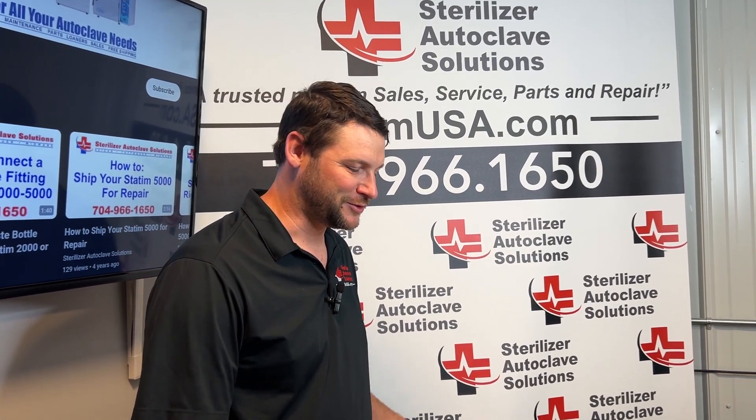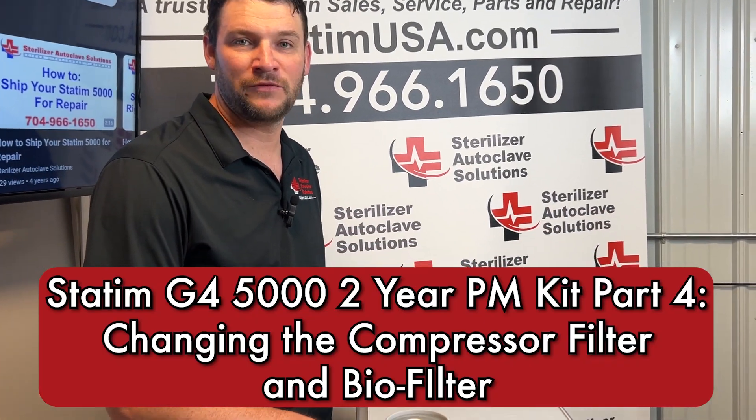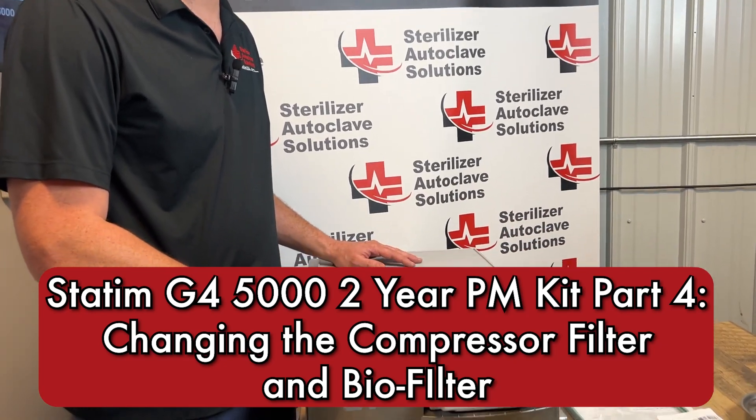Hi, this is Ian with Sterilizer Autoclave Solutions and today we are doing our two-year preventative maintenance on a STATUM G4 5000.